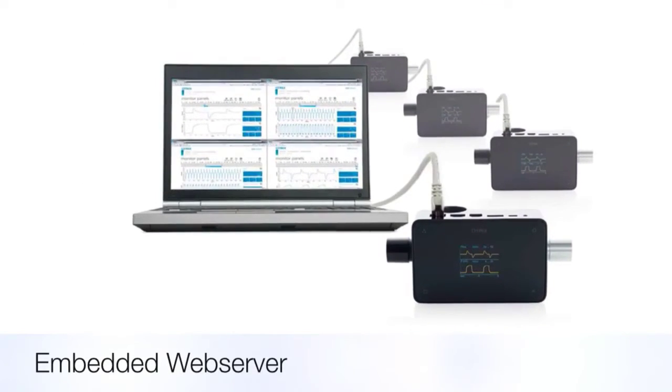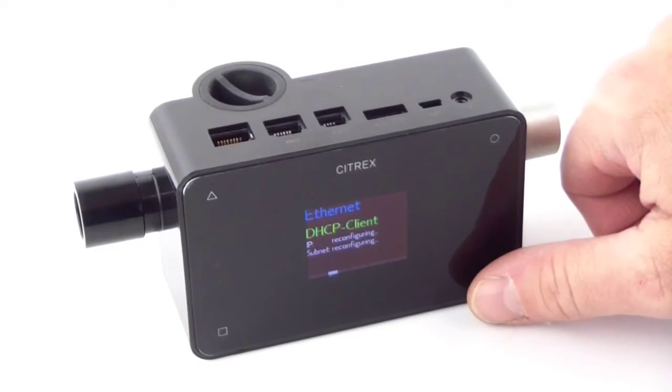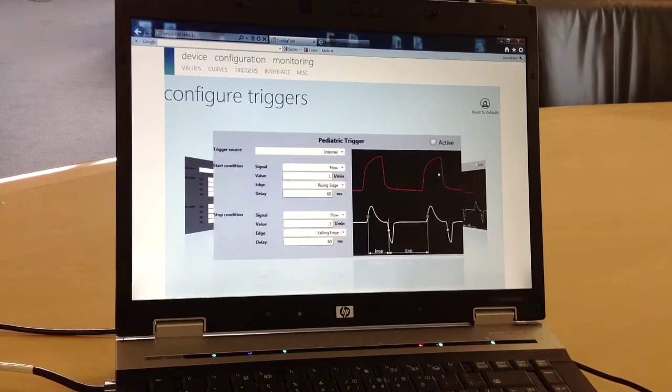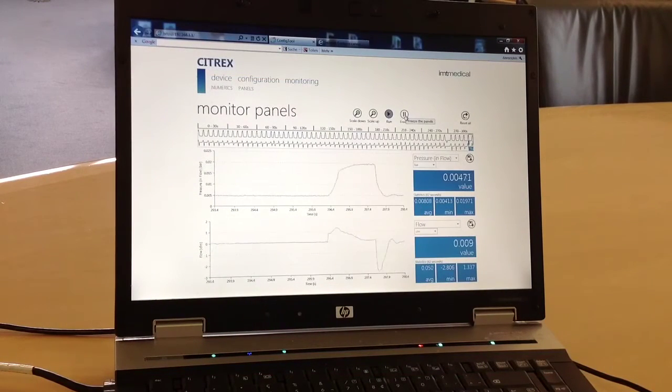Connect Citrex to your IT network. Remote monitoring over internet or access via LAN network becomes very easy. With the embedded web server, data analysis and reporting becomes simple, just in a browser.